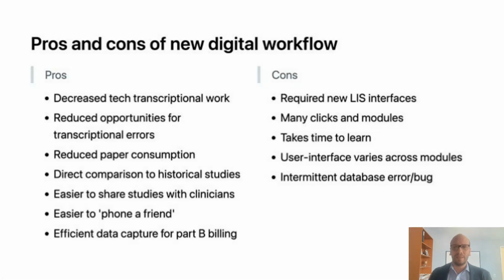So now, what have been the challenges? There was a lot of build here. We needed new LIS interfaces between Phoresis and our laboratory information system that we did not have because we did not need them for our paper process.